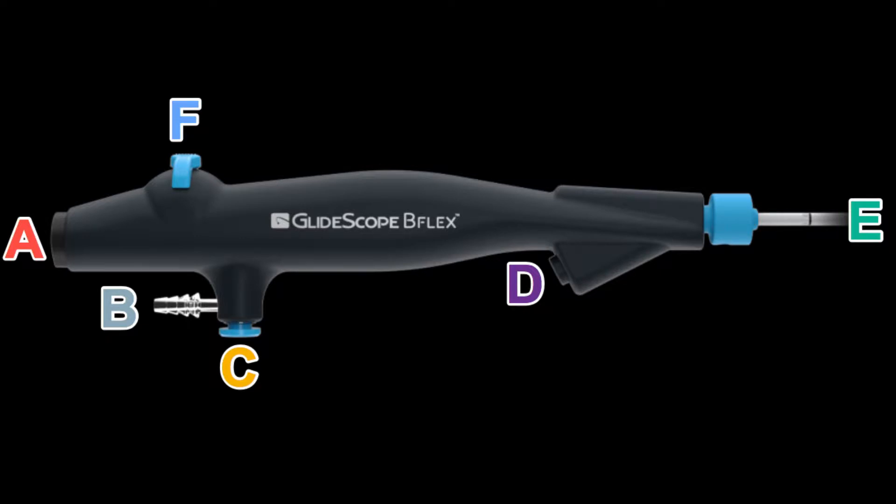The connection part will have a blue tip and there'll be a dot that matches up to a white dot on the labeled A connection part of the disposable bronch.